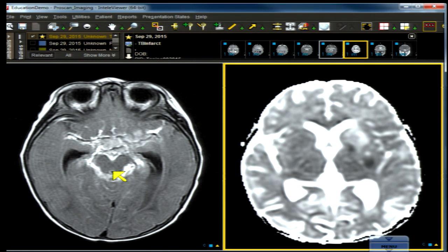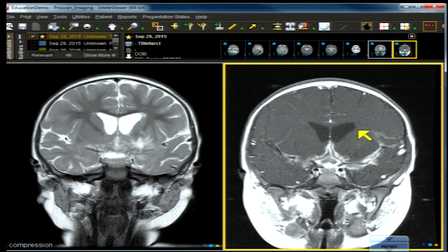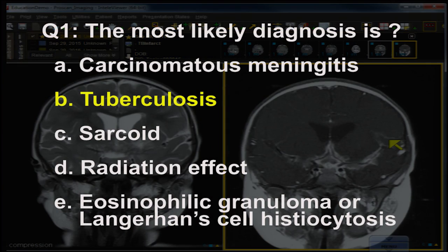The axial inversion recovery image shows extensive cisternal enhancement following the course of both middle cerebral arteries and arcing around the midbrain in the juxta-collicular plate cistern posteriorly. The diffusion restriction image shows a little bit of diffusion restriction in the corpus striatum — high signal intensity suggesting vascular compromise or diffusion restriction of another etiology. The coronal images show that same area of ill-defined signal in the left subfrontal region and corpus striatum, with enhancement of the cisterns extending quite far out, even though it's subtle and scant.